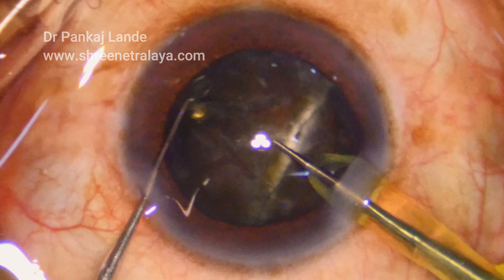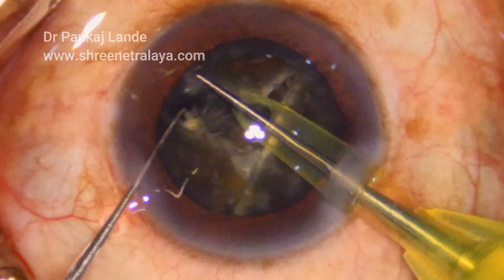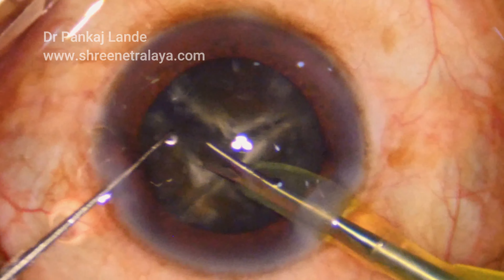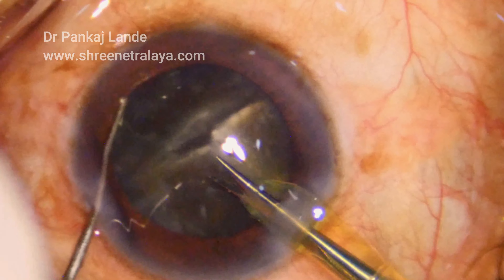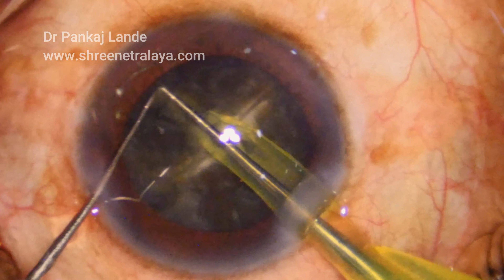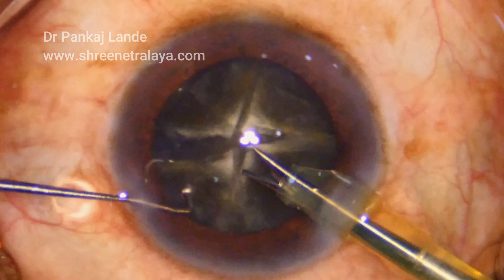You can see how tough that cataract is — a grade 5 diabetic cataract — and the ease of using this instrument is superb. I can cut this into multiple pieces. Already 4 pieces are done and I am going to divide it further. It was just like a piece of cake job.